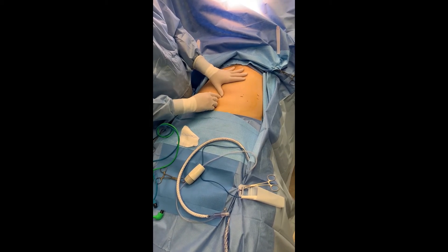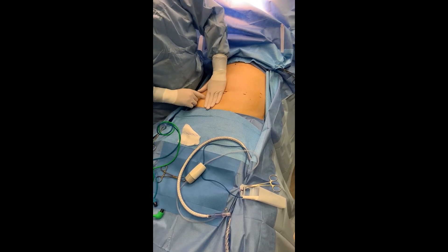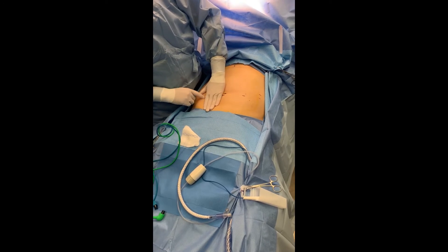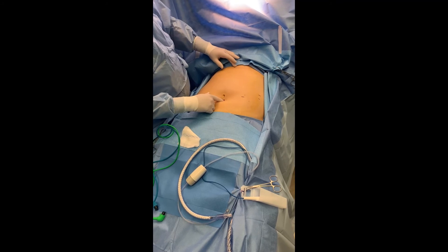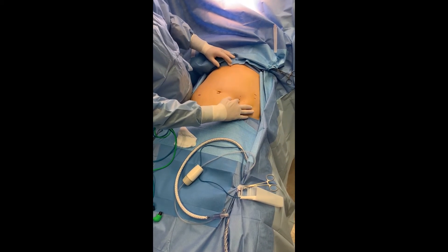I'll do an infraumbilical incision in this patient — about one handbreadth and a little bit below that. I'll put a 12 millimeter trocar for my clamp, a 12 millimeter trocar here for the robotic stapler, and then an 8 millimeter trocar about this location.